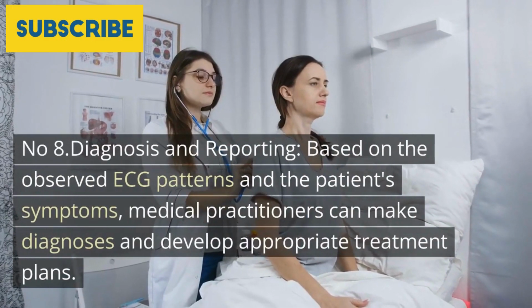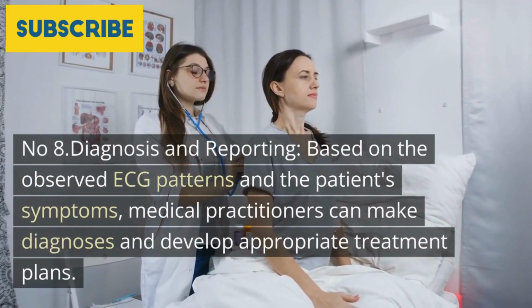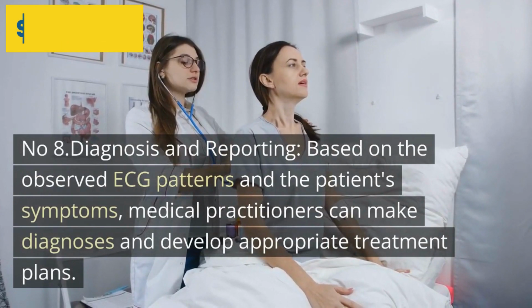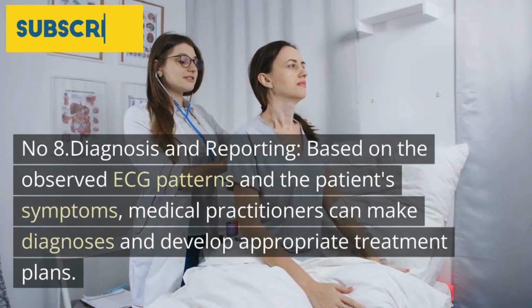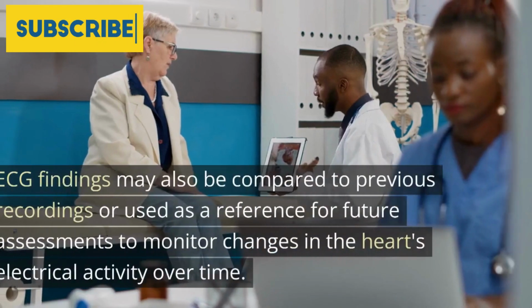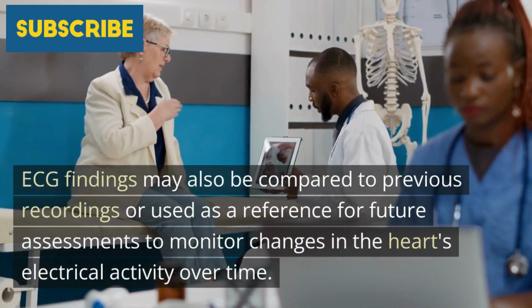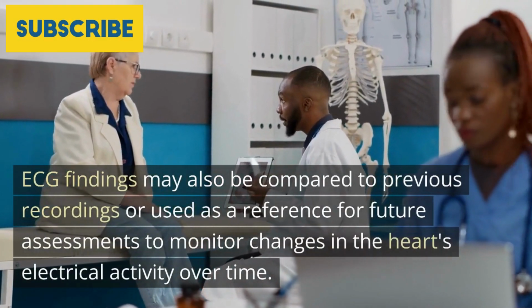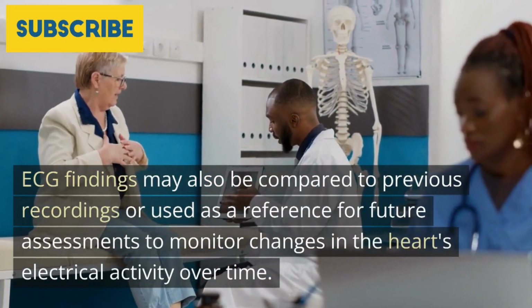Number 8. Diagnosis and reporting. Based on the observed ECG patterns and the patient's symptoms, medical practitioners can make diagnoses and develop appropriate treatment plans. ECG findings may also be compared to previous recordings or used as a reference for future assessments to monitor changes in the heart's electrical activity over time.